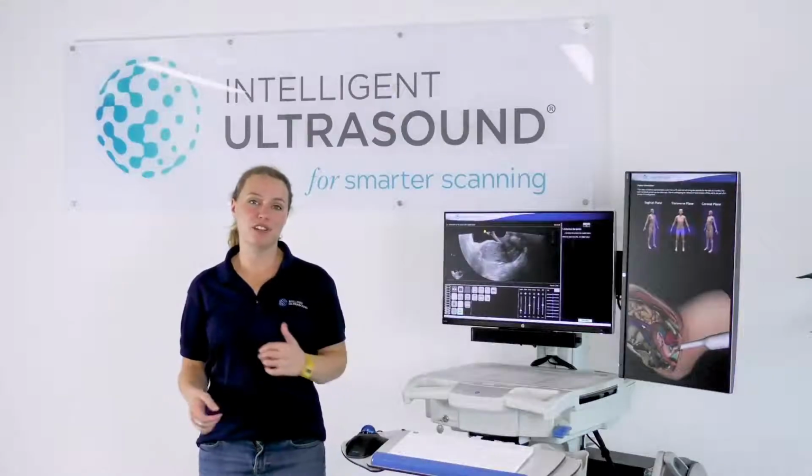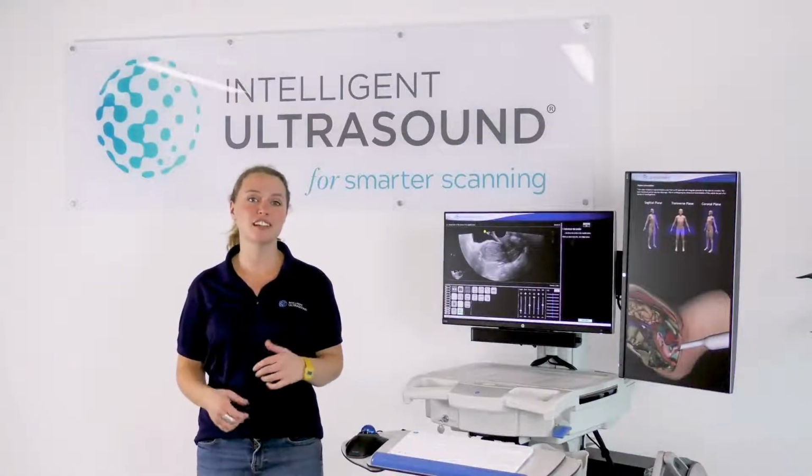Learn to scan with ScanTrainer, the most comprehensive and realistic ultrasound simulator.